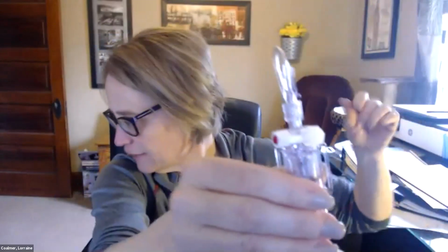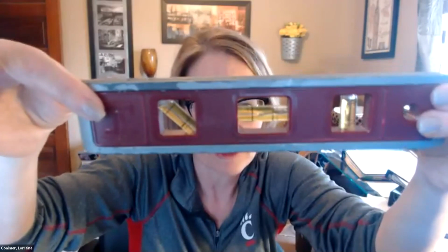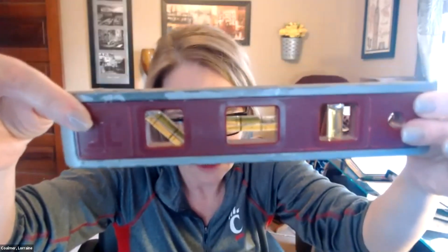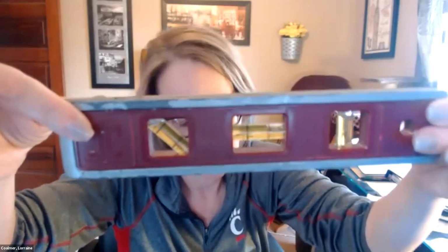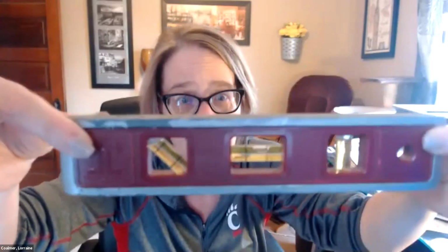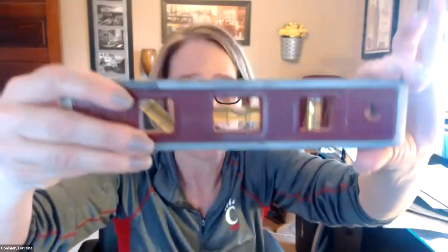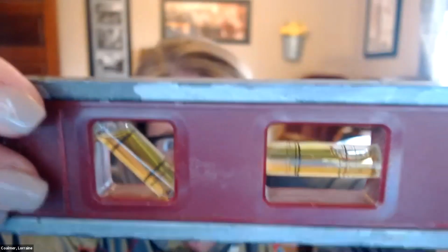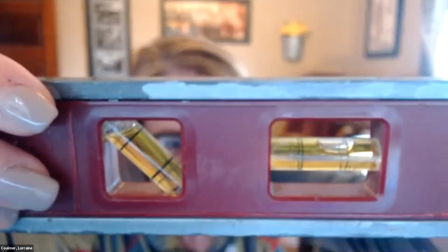What I mean by leveling is we actually use a carpenter's level. Now, if you're in a fancy hospital, they have laser levels. We do not have laser levels at Mercy. Ours are about 4 feet long. They're very long. But if you look really closely, you have to have that bubble in the center to be leveled.